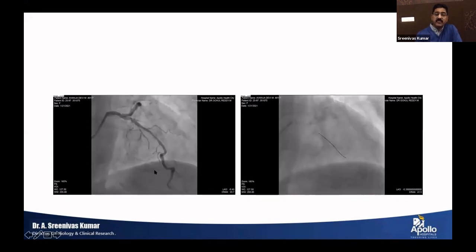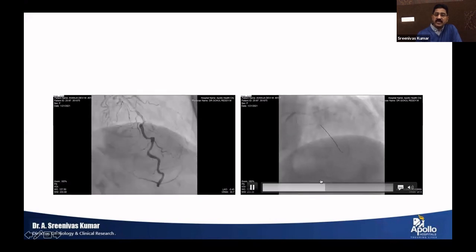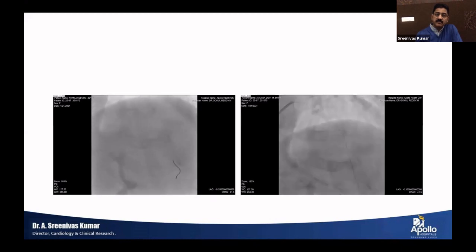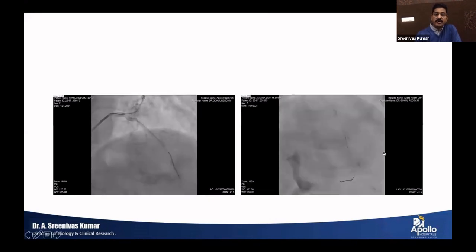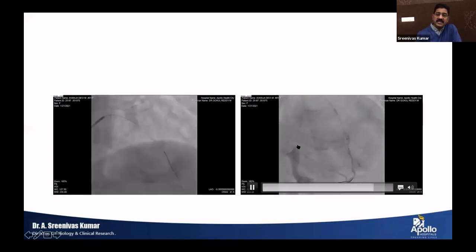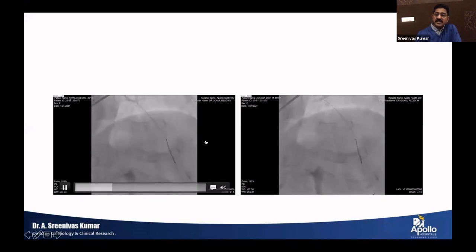So in this patient, see this tortuosity of the vessels, so many. Initially we took one wire, and luckily the wire went in easily. Then we thought we could do it. But as I said, the arteries started becoming more and more kinked. There is a small ectasia there, and the stent was getting stuck there with one wire. So we dilated it, thinking there was a tight lesion there. We dilated it, but still the stent was not tracking, again getting stuck there.